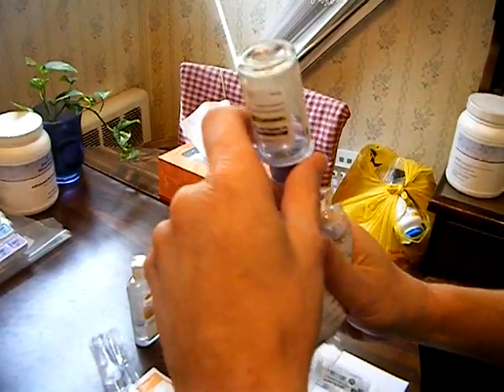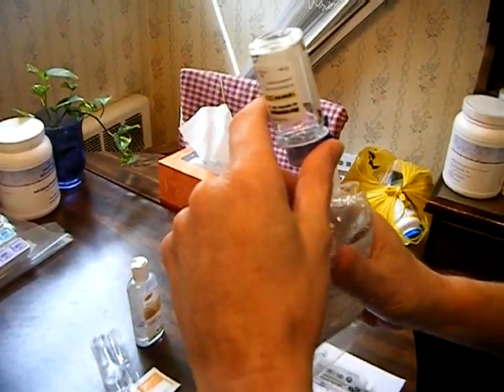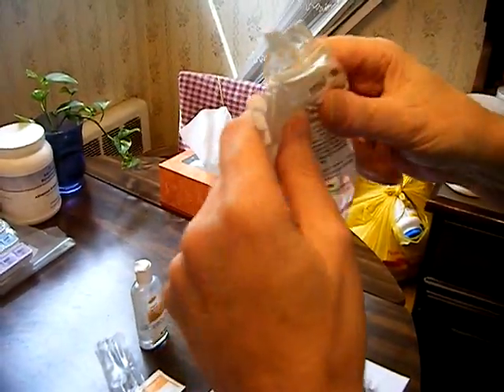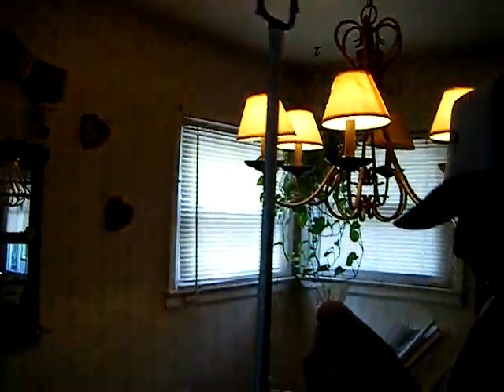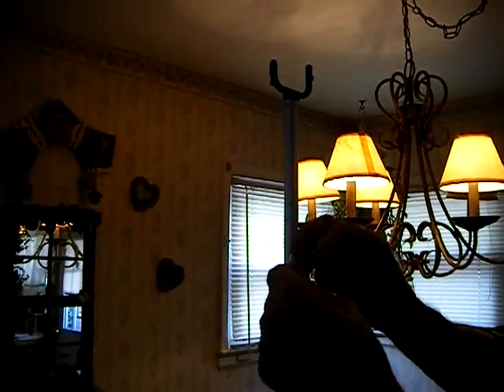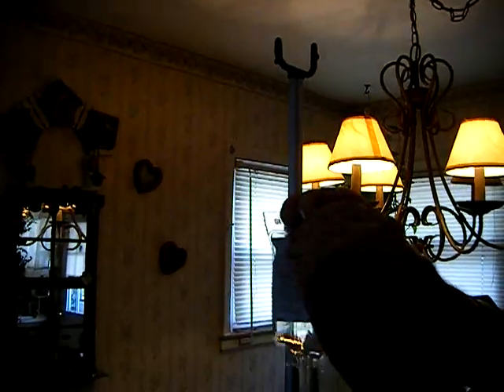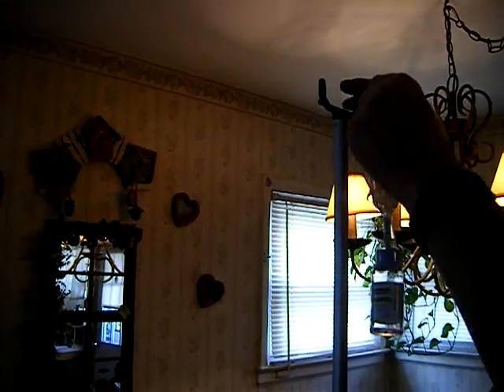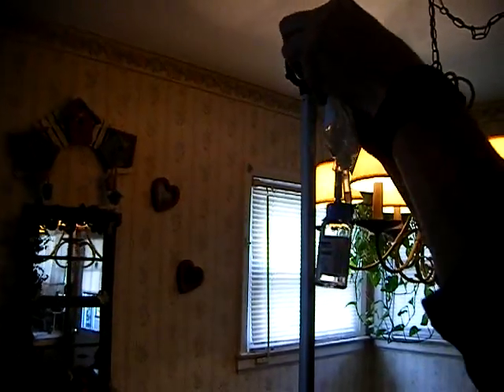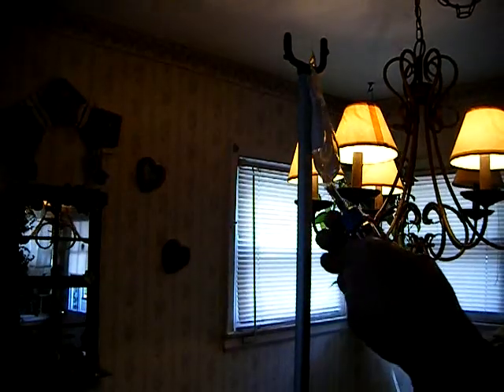We are ready to prepare the line. We're going to hang this up on the tripod here for the moment, then bring this closer to my father. Make sure your hands are clean — I used Purell and gloves if you have them. But remember, you're tearing open different objects, so if you don't have fingernails, that could be a challenge. So that's prepared.